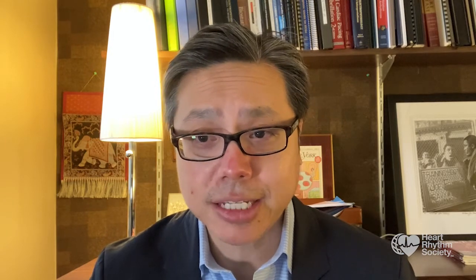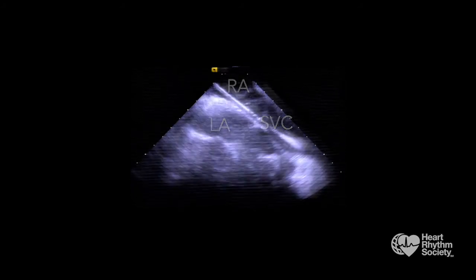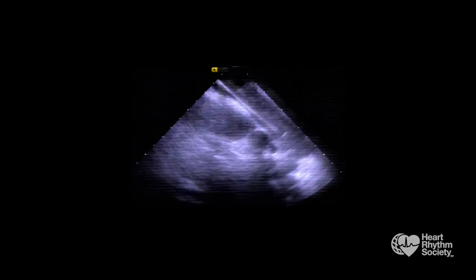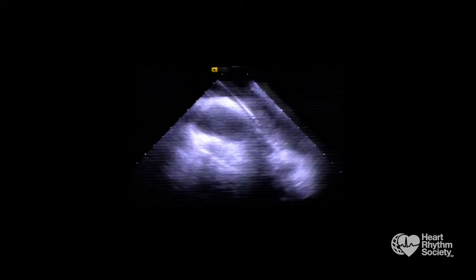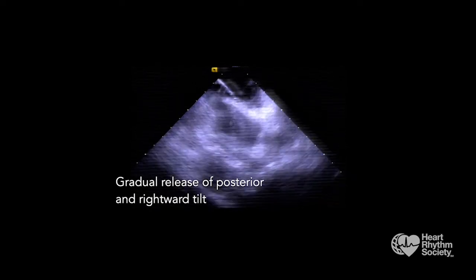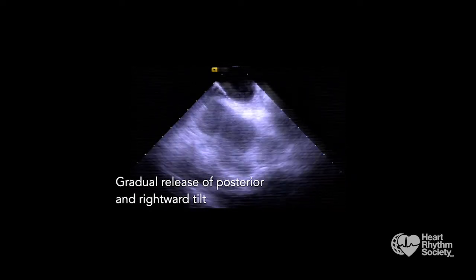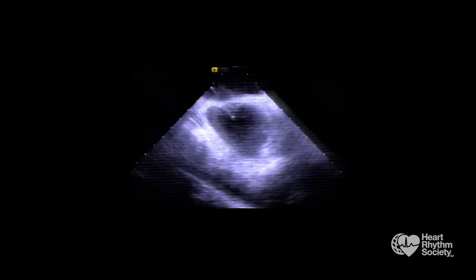You first start with an SVC view, which involves clocking the ICE catheter from the home view to show the left atrium, and then performing a posterior and rightward tilt to reveal the SVC-RA junction and long axis. This permits you to position the guide wire, needle, and sheath at the start of the transeptal. Gradual release of the posterior and rightward tilt of the ICE catheter as you pull down into the fossa will allow you to follow the sheath tip.